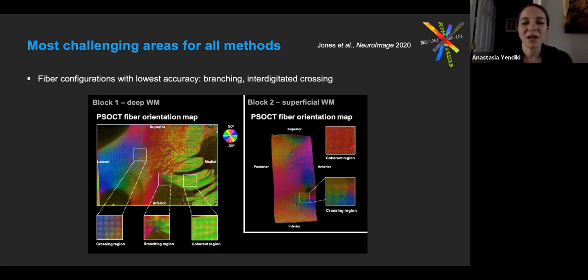There was another paper by Robert that came out in NeuroImage this year, where he showed that, in terms of the Q-space sampling scheme, a compressed sensing DSI scheme can be used both to reconstruct the full DSI data and to resample on Q shells. So with an accelerated 171 direction scheme, we can get the benefits of both having multi-shell data and having DSI data, which does seem to make a bit of a difference in terms of the accuracy.